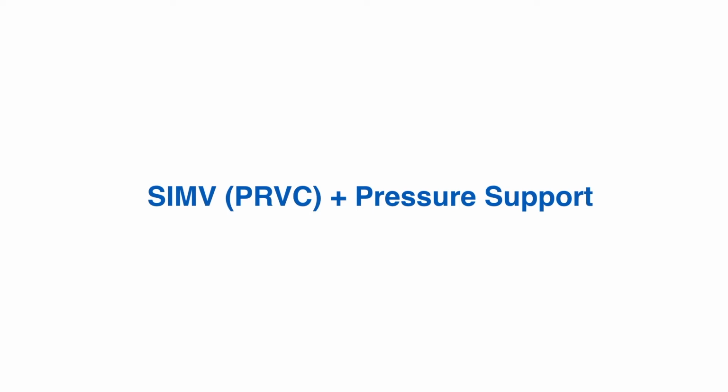You could either tell the ventilator to give a particular tidal volume or to deliver a particular pressure for the duration of the inspiratory time. And you'll see from the modes, 2 of the initial quite primitive modes are pressure control and volume control. And although I said we don't use these, it's important that I explain how they work, because it'll then make the more complex modes that we do use make more sense.